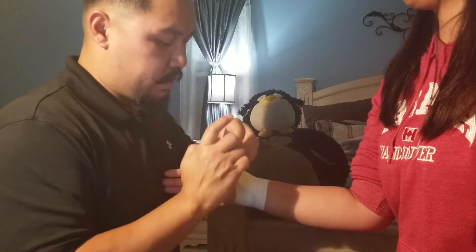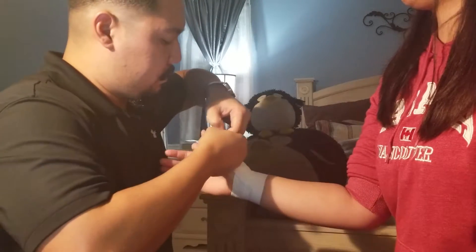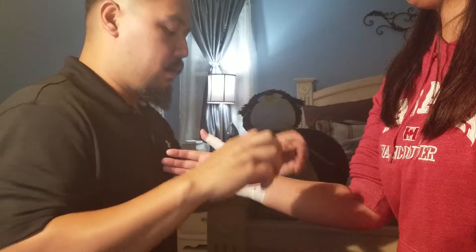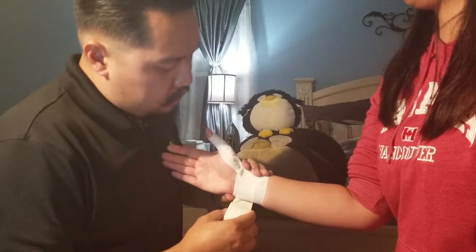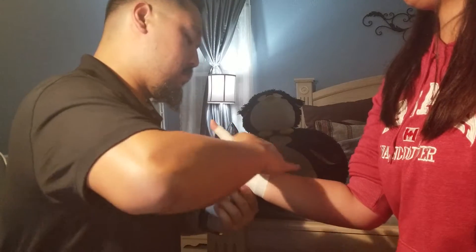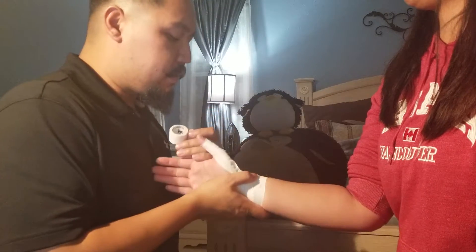Make sure those are on there nicely. You want to anchor distally and anchor again proximally. From here you want to perform three thumb spicas.